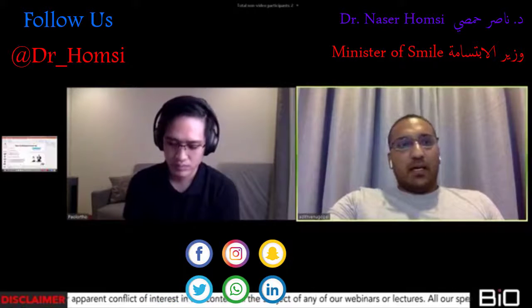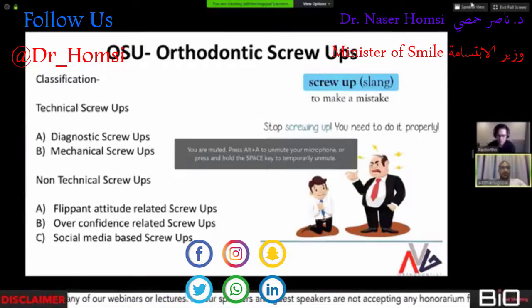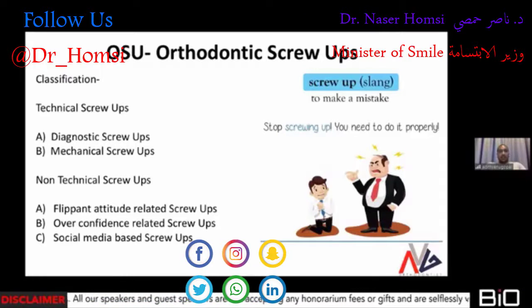Okay, so let's begin. As we already know, we've classified our orthodontic screw-ups into technical as well as non-technical. This particular topic would convene around diagnostic screw-ups as well as mechanical screw-ups, and it's also non-technical when it comes to social media-based screw-ups. Nowadays the treatment is not treatment-driven, it's more appliance-driven. I'm sure Dr. Pao would agree with me on this. I've seen so many practitioners decide even on extraction versus non-extraction based on the appliance they use. That's not the right way to deal with things. It should be the other way around. We should diagnose first, and then choose what kind of appliance is best suited for that kind of treatment. So that becomes a diagnostic botch-up by itself.